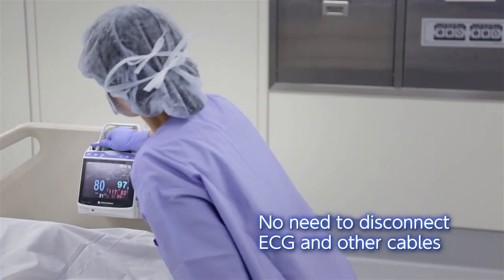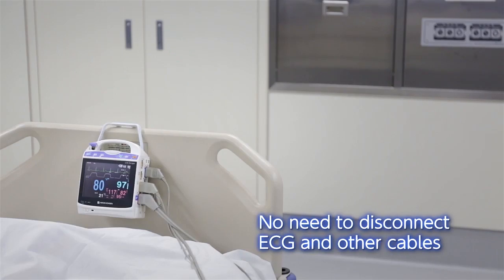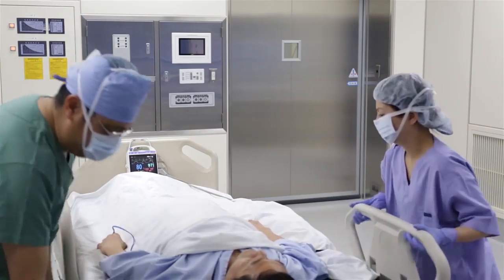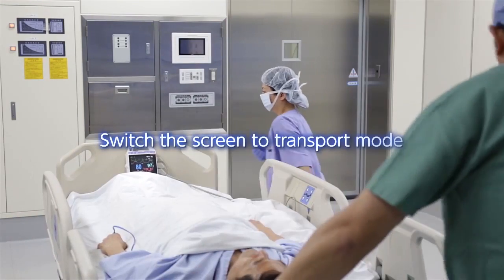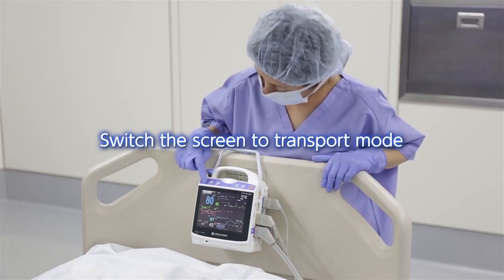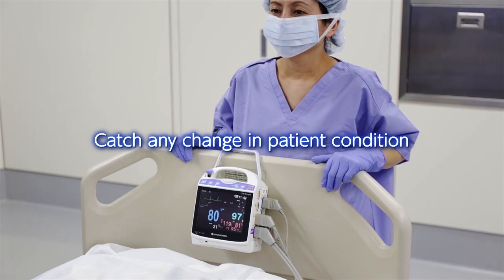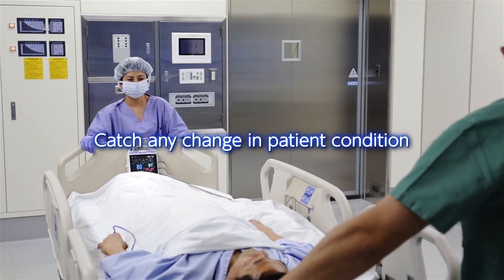There is no need to disconnect any cables. With one touch, the screen of the LifeScope PT switches to transport mode with large numeric data. Large numeric data makes it easy to see any change in patient condition.